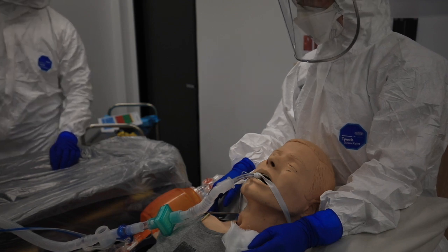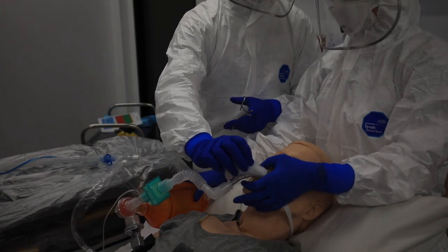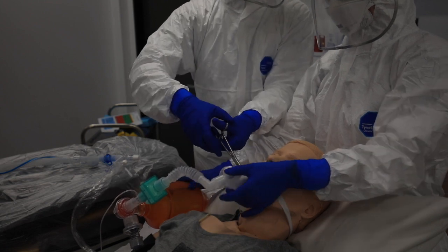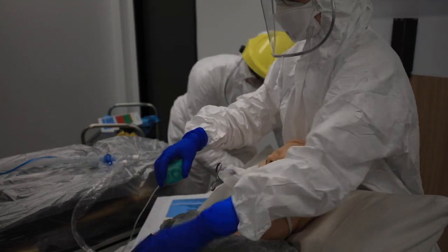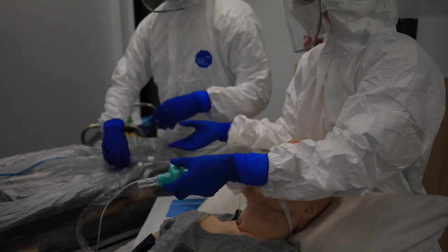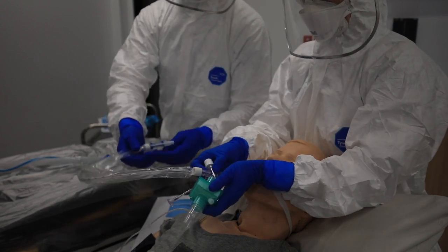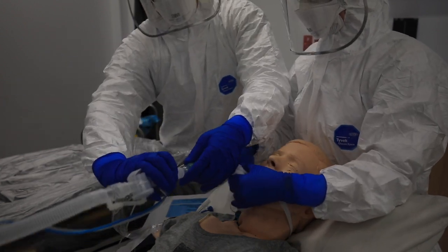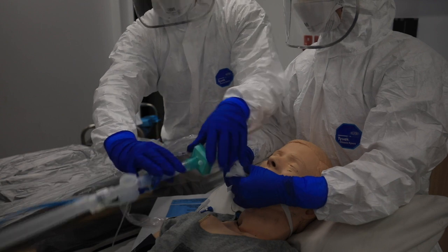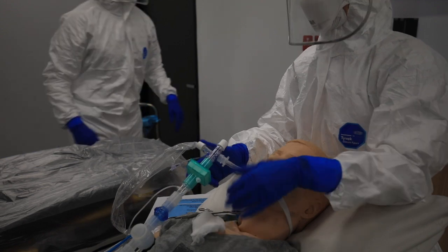Exhale — clamp applied to tube. Disconnecting circuit. Suctioning. Push and twist connection secured. Left tube tie on. Nothing messy.